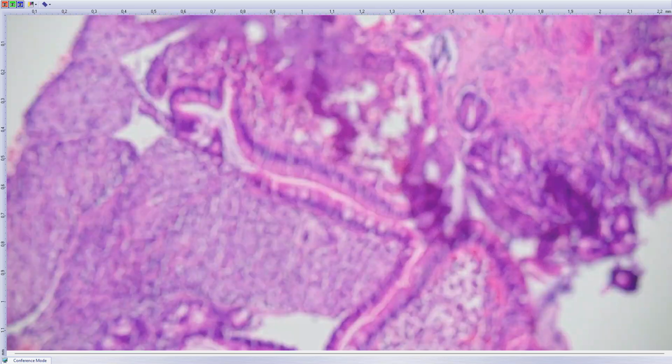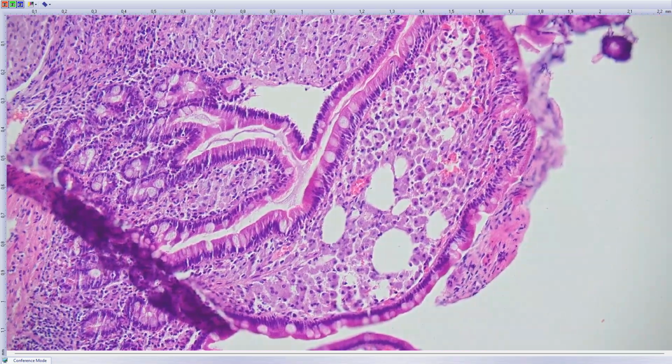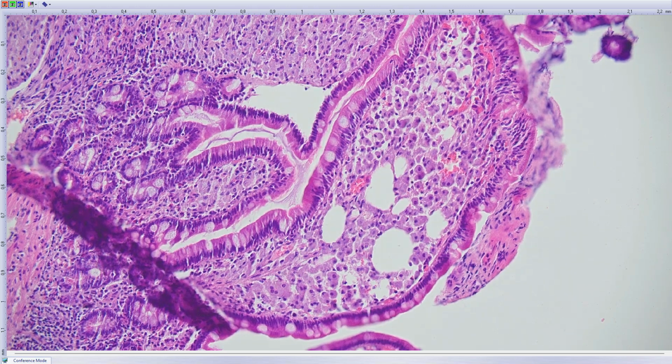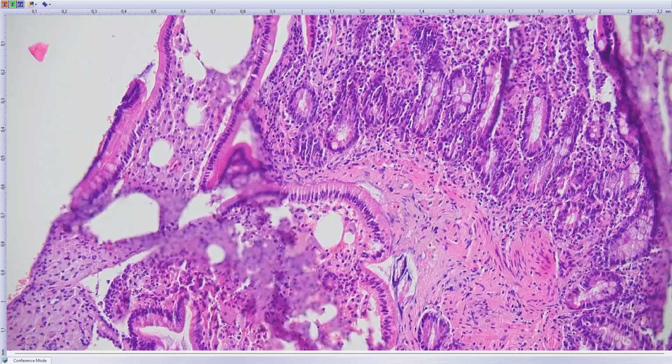Epithelium is completely normal, but the abnormal thing is lying down there in the lamina propria. The lamina propria is completely filled with these foamy macrophages. And an additional thing you can see here are these dilated cystic spaces. Most of these will be, if we stain, dilated lymphatic channels. And this is how this disorder causes malabsorption, by blockage of lymphatic vessels in the small intestinal mucosa.